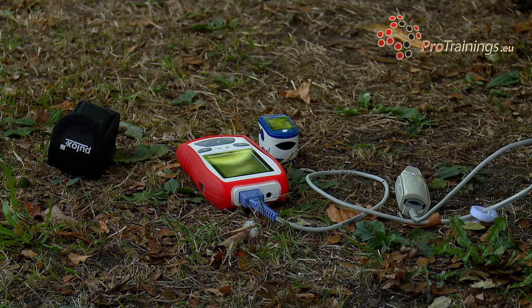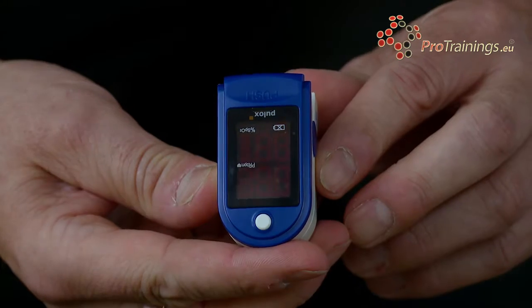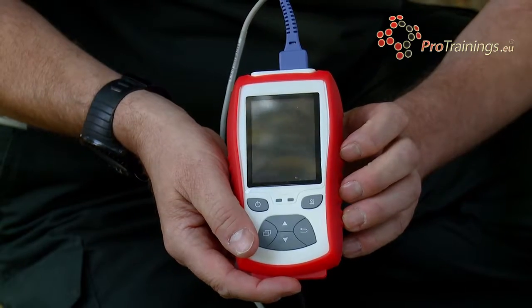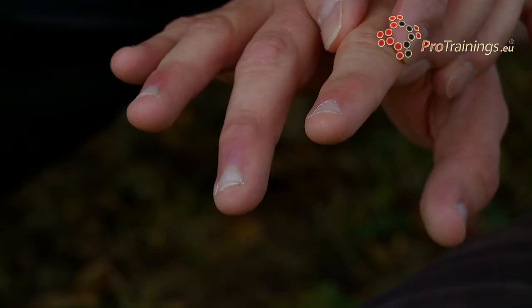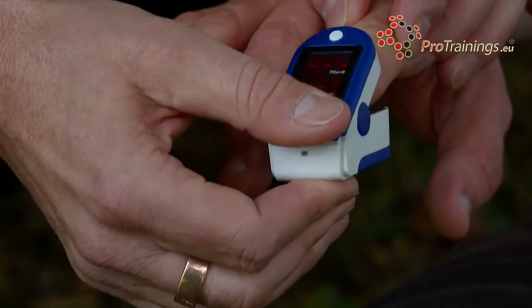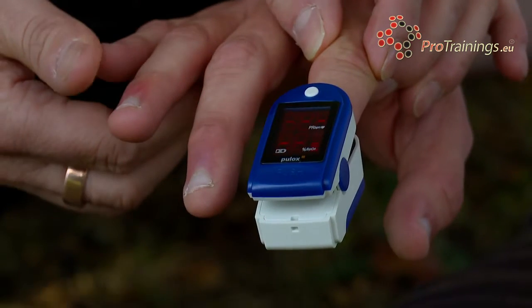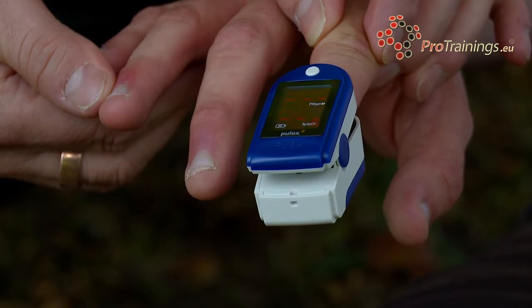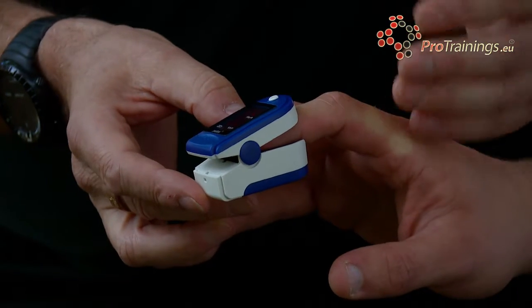So, pulse oximeters themselves, there are 2 types. There's the small finger probes or the more complex ambulance type probes. So we'll look at the finger probe for a start off. We turn it on. Once we've made sure that the finger is clean, there are no oils, grease, no nail varnish or anything else on the finger itself, it is clipped onto the finger. Now we're looking for an oxygen saturation. These will give you an oxygen saturation and a pulse of the heartbeat.